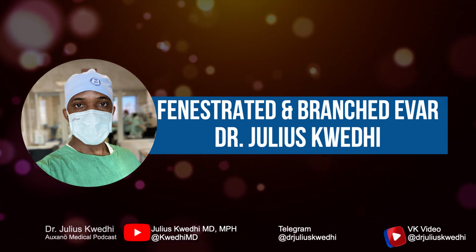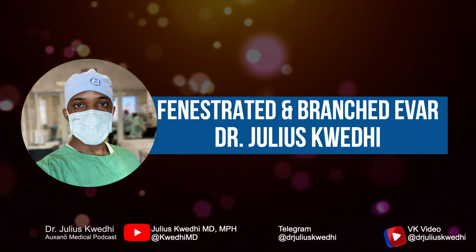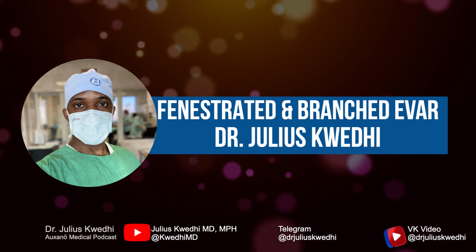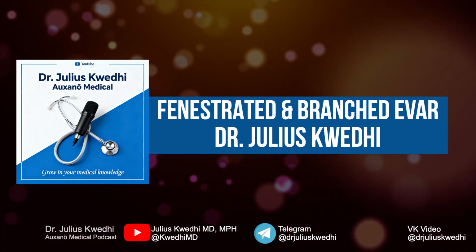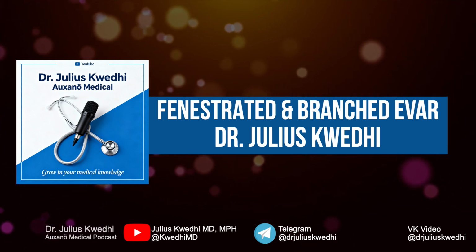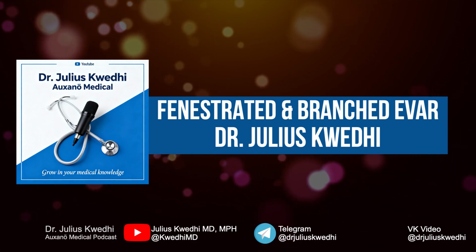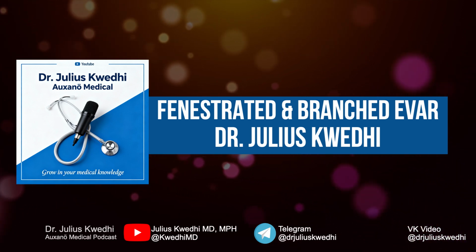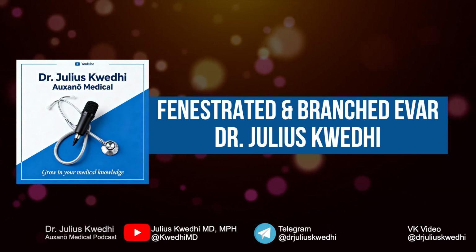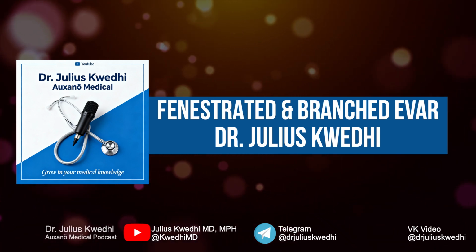In the analysis by Mendez and colleagues reviewing over 890 patients who underwent fenestrated or branched repair, technical success was 99% in the non-prior EVAR group and 97% in patients with prior failed EVAR. The U.S. Fenestrated and Branched Aortic Research Consortium data similarly demonstrates high technical success with appropriate patient selection and operator experience. Let's discuss the perioperative period.